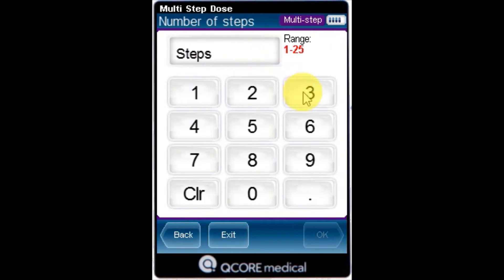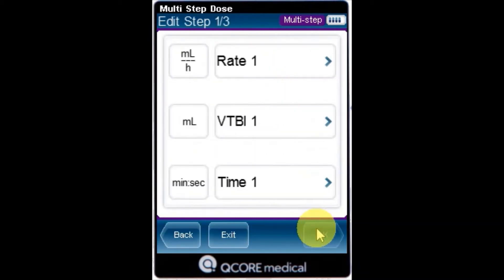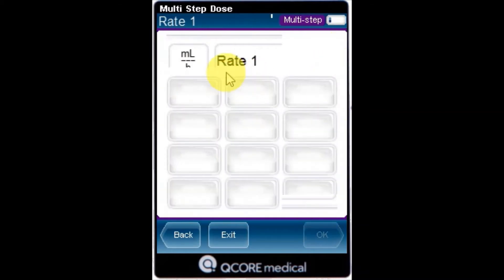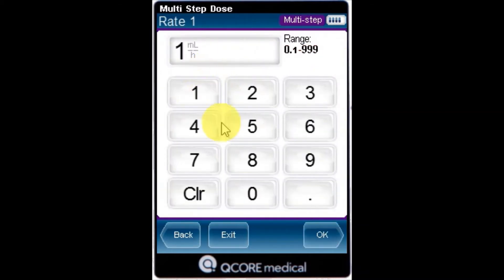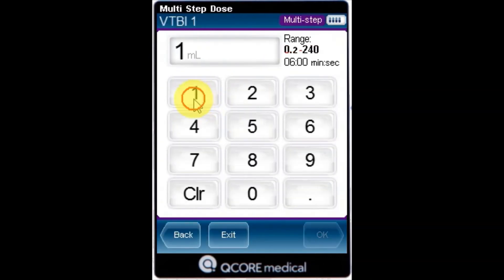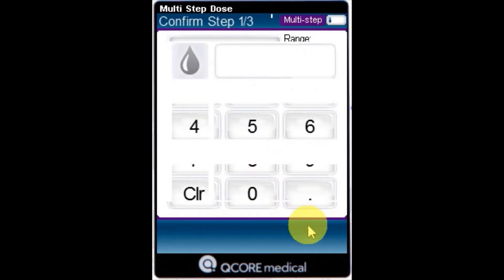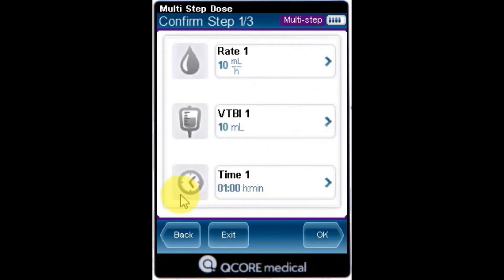Using the keypad, enter the number of steps required for the infusion and then press OK. For the first step, program two of three parameters — Rate, VTBI, or Time — by selecting the relevant boxes. The third unprogrammed parameter is then automatically calculated by the pump.